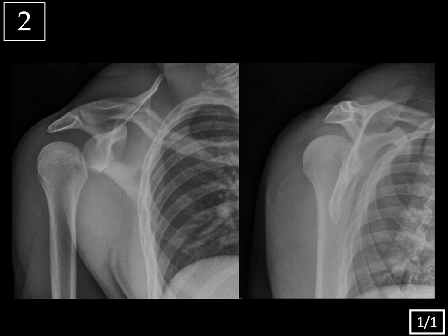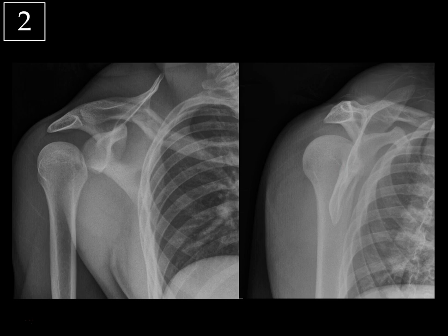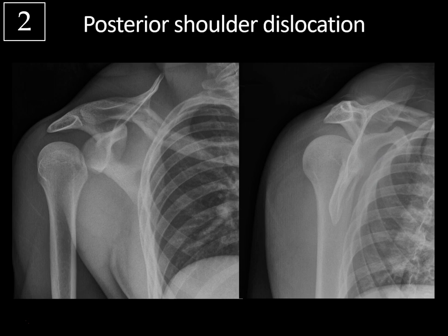Case 2, another shoulder. This time we're looking at the right shoulder. On the frontal view the humeral head has a lightbulb appearance — it's fixed in internal rotation. We also don't have the normal overlap with the glenoid that we would expect. On the scapular Y view, the humeral head is dislocated posteriorly to the glenoid. Compared to the last case where the humeral head was anterior, this is typical for a posterior shoulder dislocation.